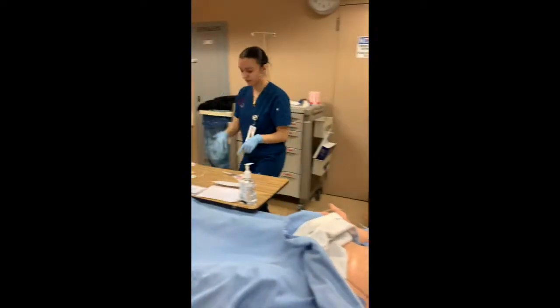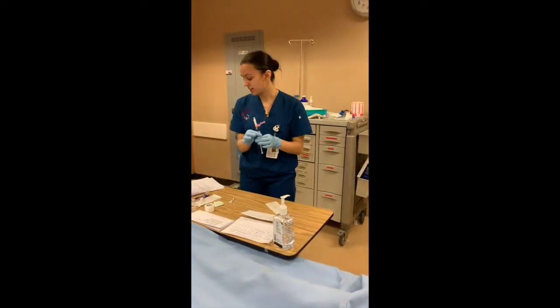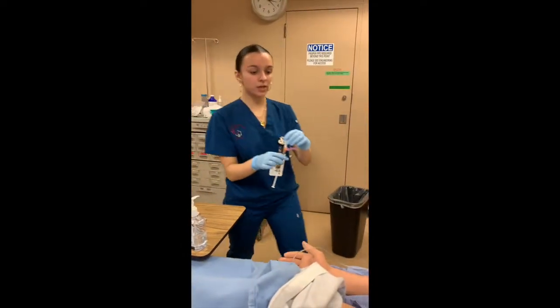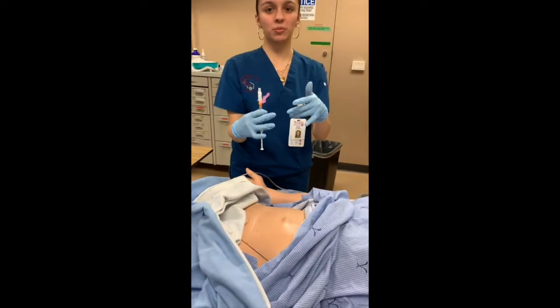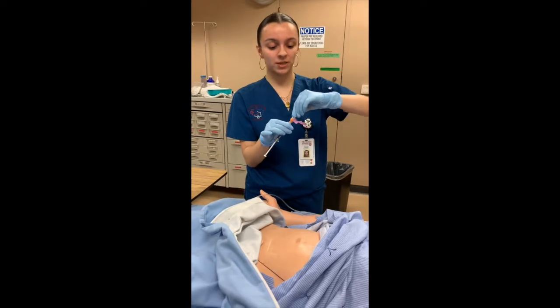So next what I'm going to be doing, I'm going to be giving the heparin, which is the subcutaneous medication. You want to make this as quick as possible but effective so that the patient's not in a lot of pain. So I'm just going to be taking the cap off.